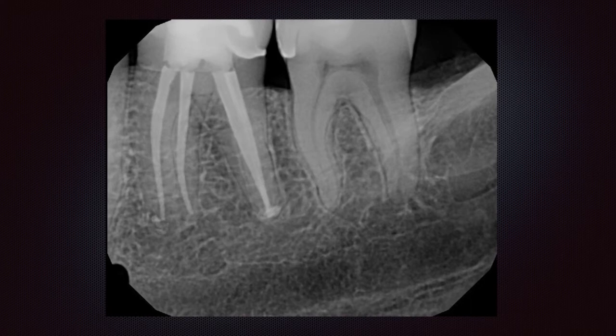And it's interesting because it gives me a chance to now have a comparison on the same patient: 4 years ago the EndoSequence and the Bonded Obturation, and now we're going to move to this EndoSequence Express, or ESX file protocol, with the Bonded Obturation. But what's interesting is to take a look at that other tooth that I treated 4 years ago.